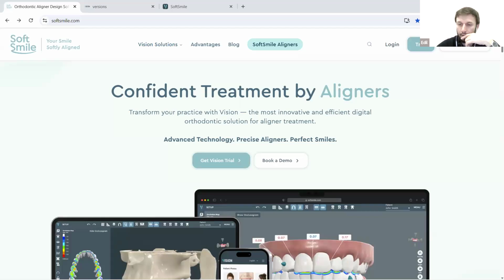Okay, got it. Yeah, I know there's some handling required. We are optimizing this feature. It's not part of this release. I will talk to our developers and we can come back to you on that, but I can assure you that we are working on enhancing the post-processing to give you more optionality and to make the process smooth. Can you explain the different options when exporting?